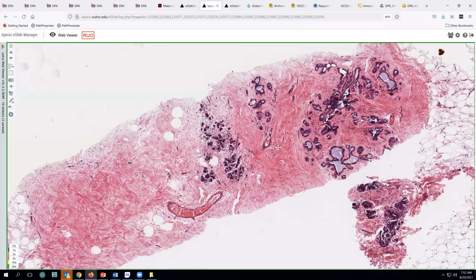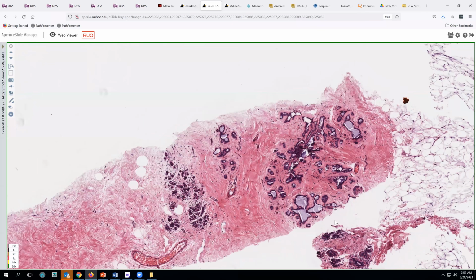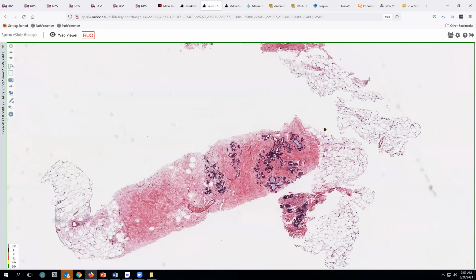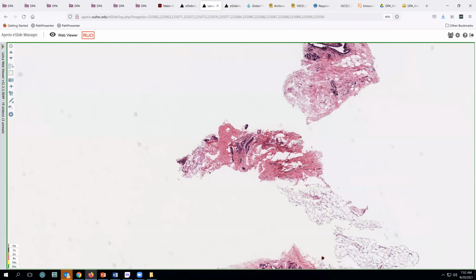And so if we would just report a biopsy like this as benign breast tissue, that's not very helpful to him. And it may not be a good service to the patient. On the other hand, if we report that we see a moderate area of stromal fibrosis with benign ductal structures and lobular structures with slight ductectasia, well, then he's able in that circumstance to say, does what the pathologist saw correlate with what I saw?